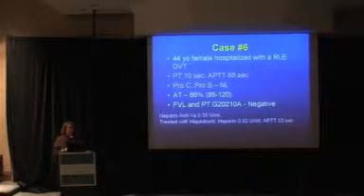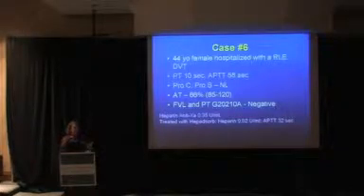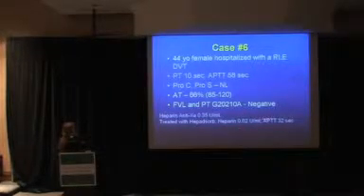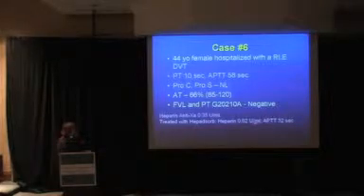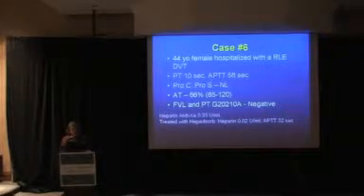We've had several patients, and we probably get a couple of these a week, that actually are on heparin and have a lupus anticoagulant. In those individuals, say their PTT would be 58 seconds, they've got positive heparin, you get rid of the heparin and their PTT may still be 50 seconds. If you see that, then you could go and do lupus anticoagulant testing. But I like to do the heparin assay afterwards just to make sure we've gotten rid of the heparin. In this case, I wouldn't pursue it any further since the PTT normalized after we got rid of the heparin.